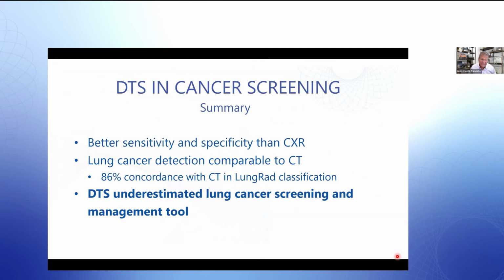So, summarizing, something that really surprised me: I only learned about the undervalue of chest X-ray from going to the last lung cancer screening association meeting, and only discovered the incremental value of tomosynthesis over the last couple of years in terms of lung.